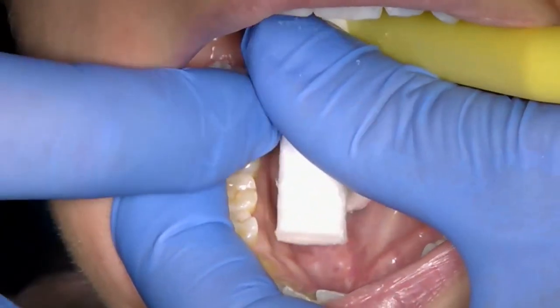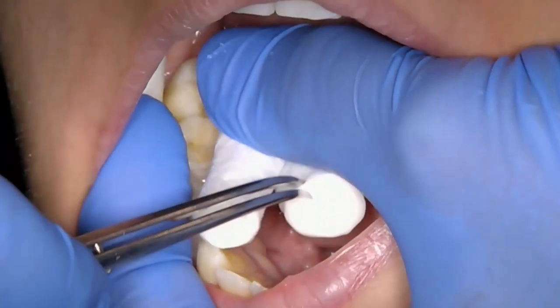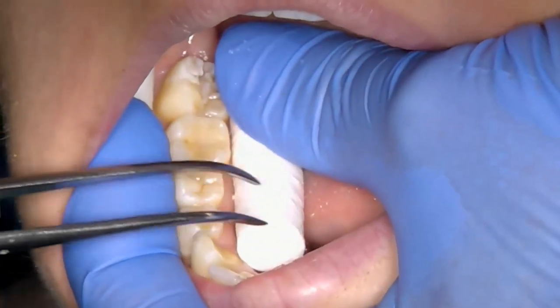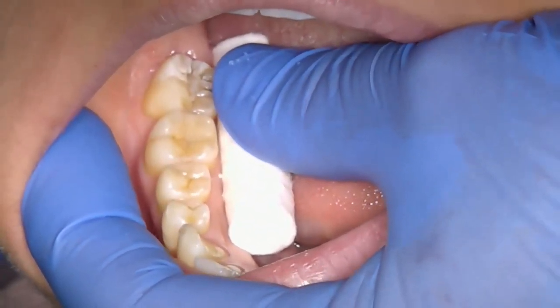Remove the wet cotton wools and replace with dry ones, ensuring that the tooth does not get contaminated with any saliva. If saliva contamination does occur at this stage, you will need to re-etch the tooth using the same procedure.